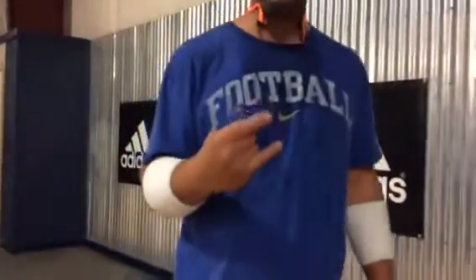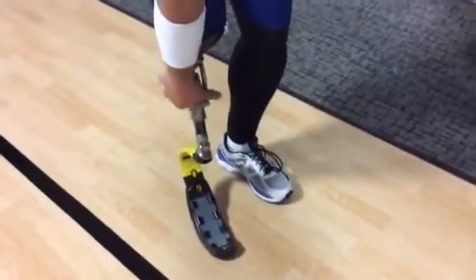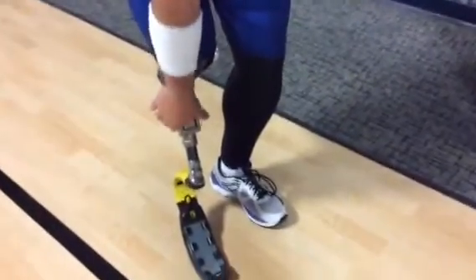Those are two different running styles as an above knee amputee you can use. I have a cheetah foot, I have a meta knee, and it allows me to do both. Sometimes I will lock this with a nut and bolt, a little invention we have, so that it doesn't bend. That way I can run circumduct without worrying about my knee bending.